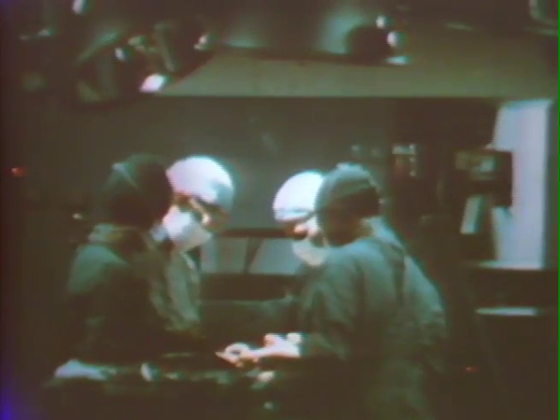This film has been prepared to present the philosophy that the ultimate goal of our training program is management of the patient entrusted to our care. Our evaluation of the patient, our preoperative care, our conduct of anesthesia during surgery, our post-operative care are all part of the total responsibility of the anesthesiologist. The development of anesthetic agents such as halothane demand highly sophisticated skills and techniques for their administration.